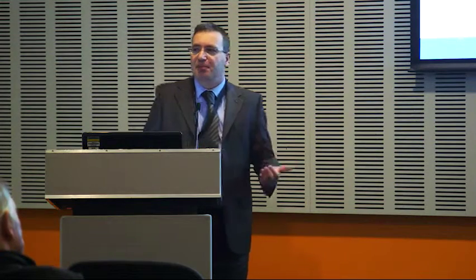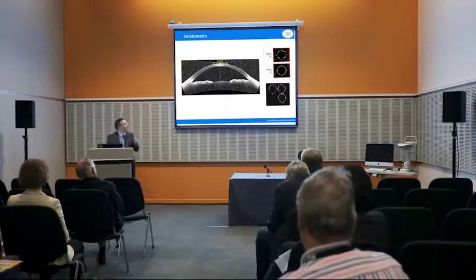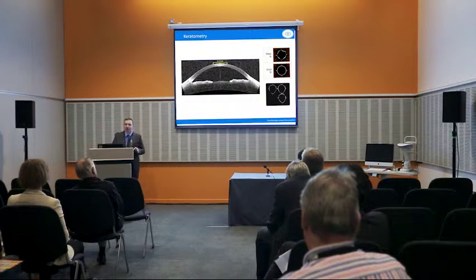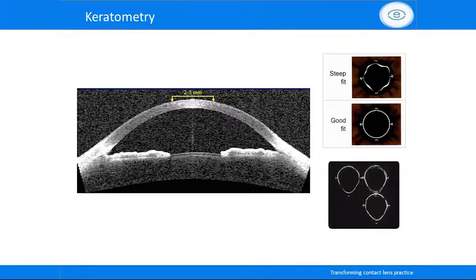So let's just step back a little bit and think about what tools we have in practice that actually enable us to measure. With keratometry, we're limited to that central 2 to 3 millimeter corneal cap. But as we've seen from the previous ASOCT slide, actually that's a gross misrepresentation. It doesn't take into account any of the change in peripheral corneal shape and the eccentricity of the shape.